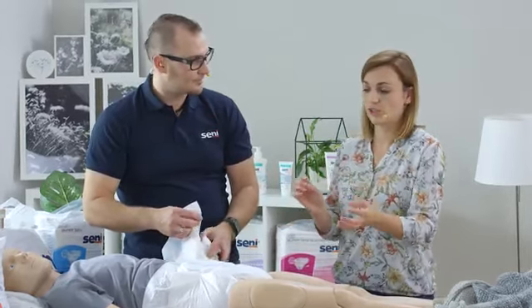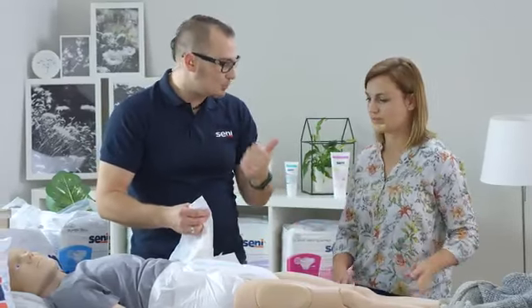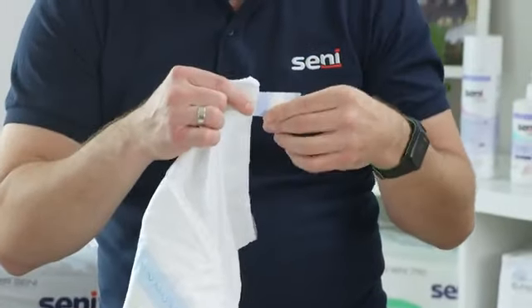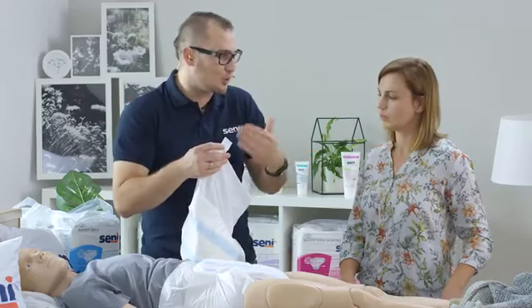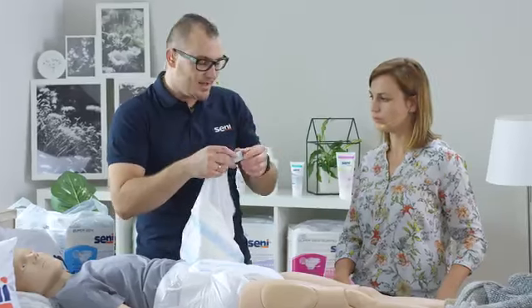What about skin safety? Exactly. The vapor permeability provides skin safety, as we said at the very beginning, in addition to these elastic elements, because they cannot be made of latex. Latex, as a natural organic material, is one of the greatest allergens.